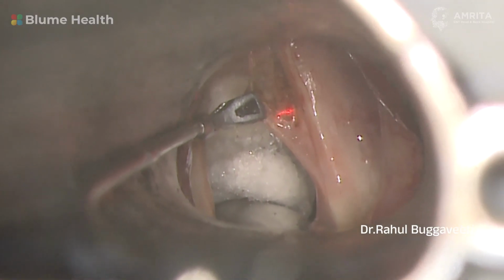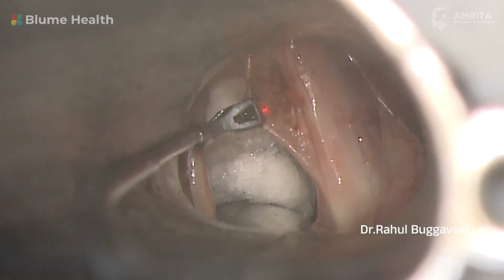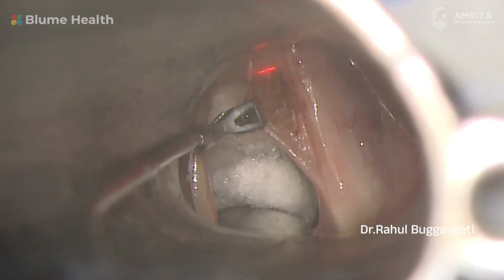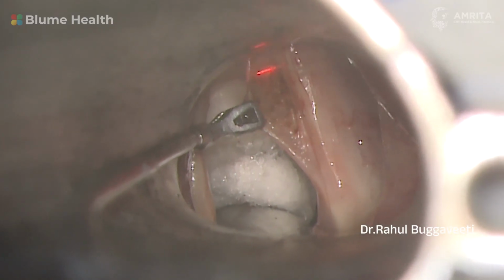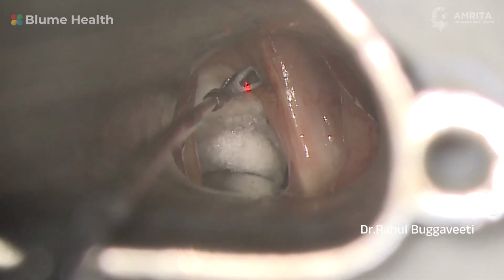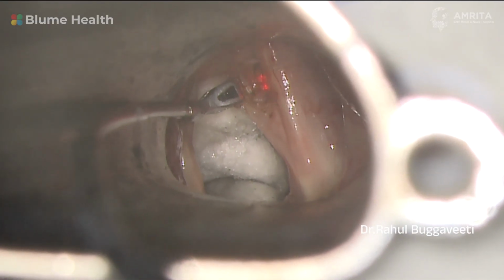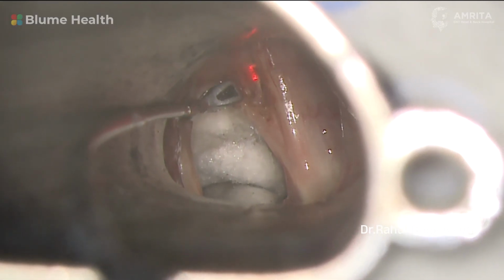So sometimes it will be difficult to separate the cyst wall from the mucosa, as the mucosa is a very thin layer. In these cases, we resect part of the mucosa along with the cyst wall so that we don't leave behind any cyst wall. This reduces the chance of any recurrence. And the defect generally heals well and there won't be any change in the voice post-surgery.